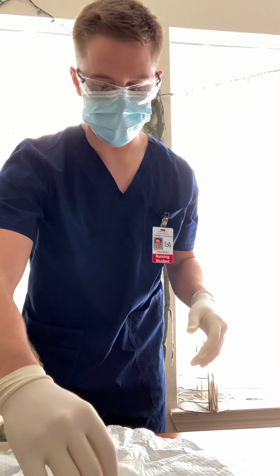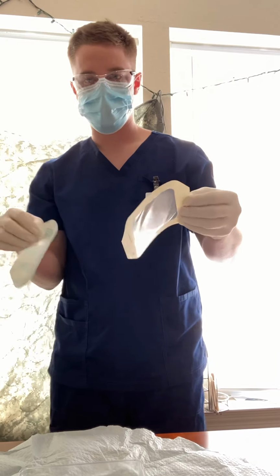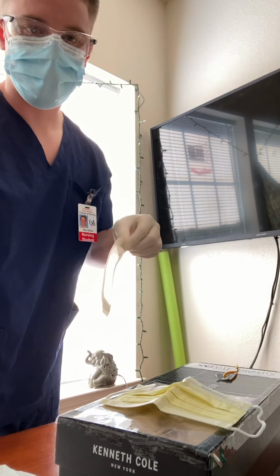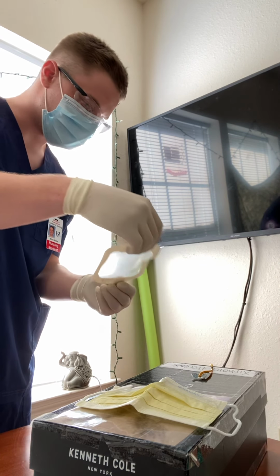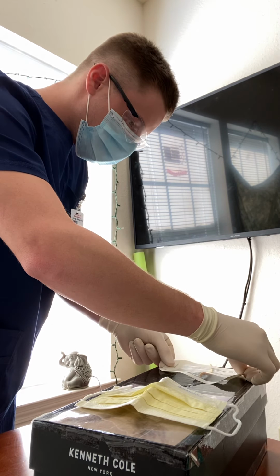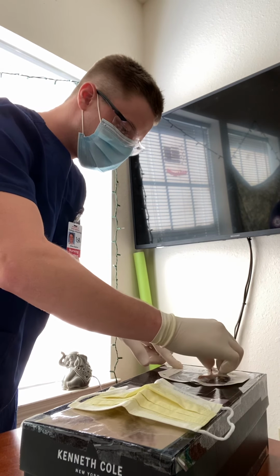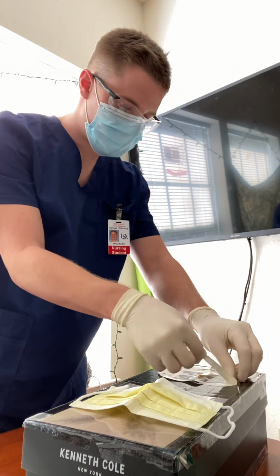I'm going to get my tegaderm. Now I'm going to remove the outer portion, dispose above waist level. I'm going to move the camera again, and I'm going to make sure you can see. So I'm going to apply it all the way over the green hub of the site. And then removing the outer part of the tegaderm.